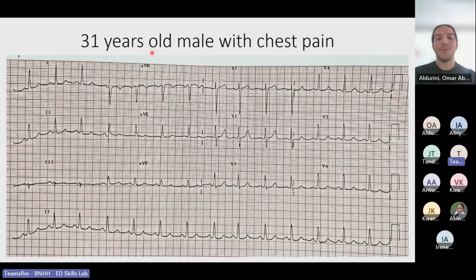Okay, we can see two of the three points of standardization. The first point is the voltage, how the voltage is represented, either written or represented by this inverted U wave. If you count here how many small squares, let me use my mouse.